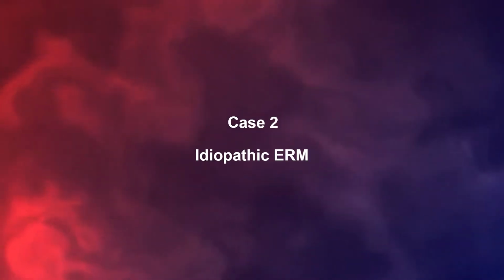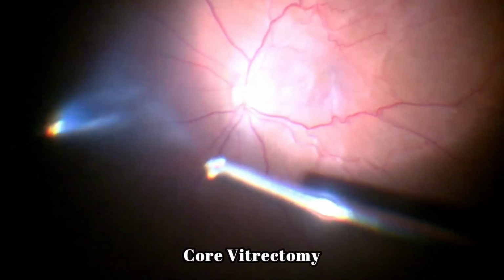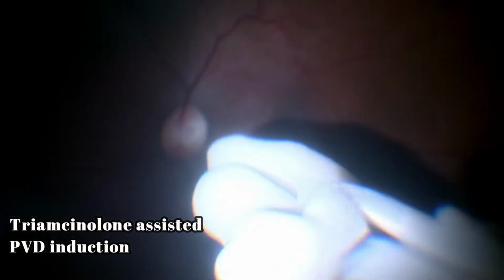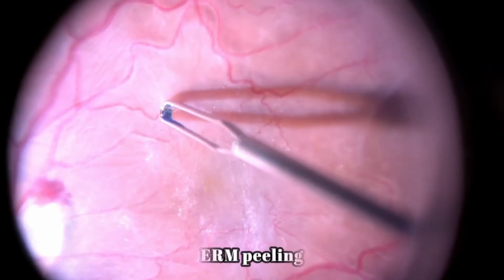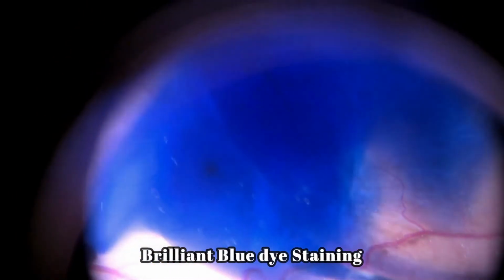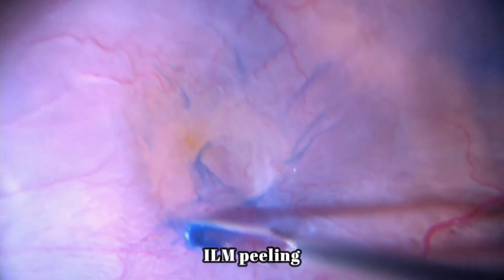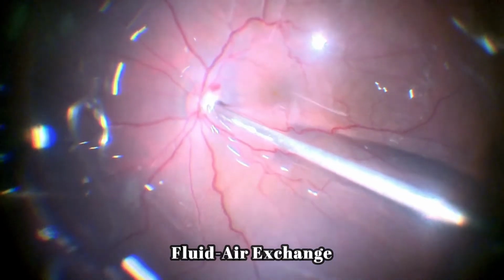In a case of idiopathic epiretinal membrane, surgery is initiated with core vitrectomy followed by Triamcinolone assisted PVD induction. The membrane is peeled with the help of a forceps. The internal limiting membrane is stained with brilliant blue dye followed by its peeling. Fluid air exchange is carried out and the cannulae are removed.